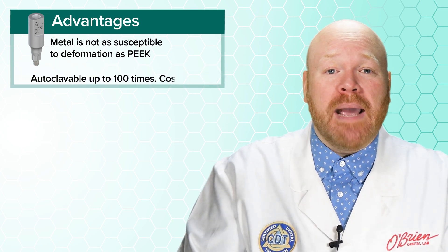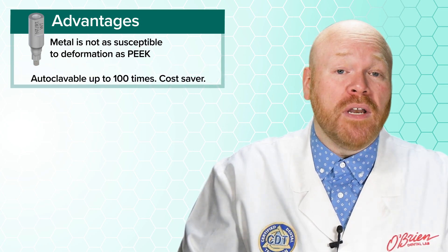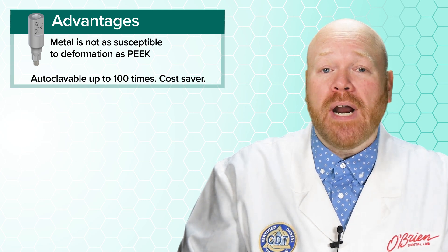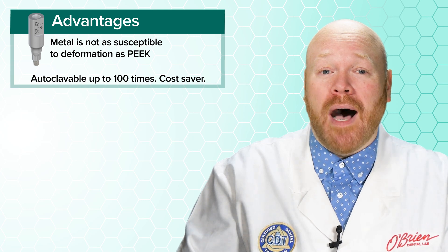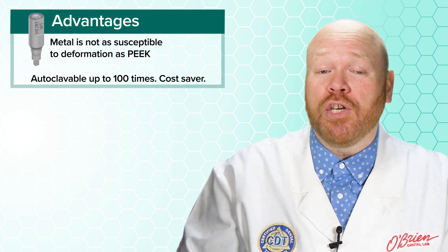Second, these metal scan bodies are autoclavable up to 100 times, and at the current price that's less than 60 cents per use. If you restore a lot of Strauman implants, this is a huge cost saver.